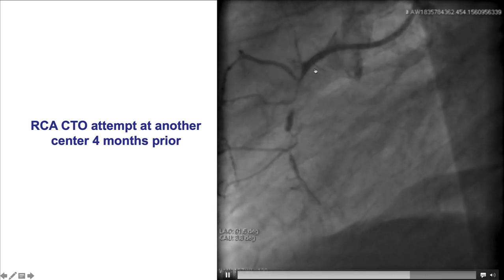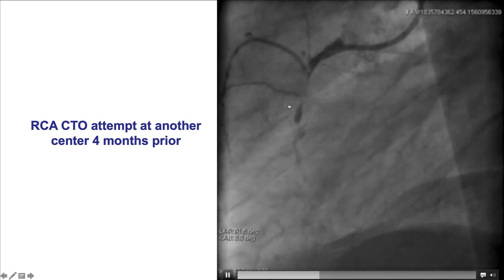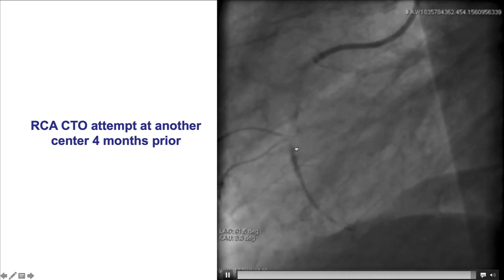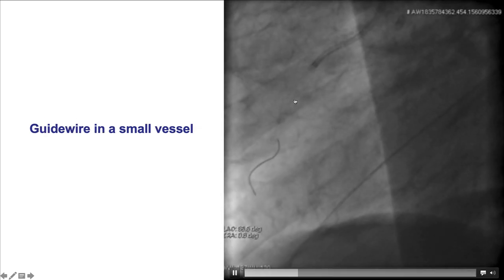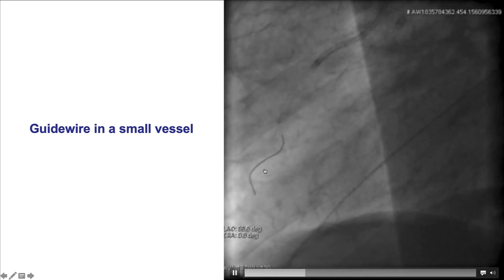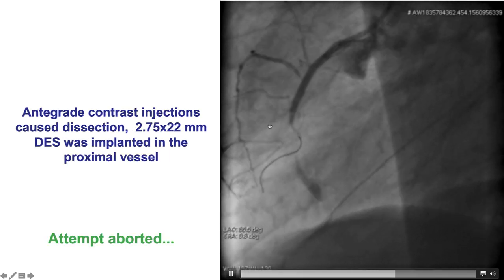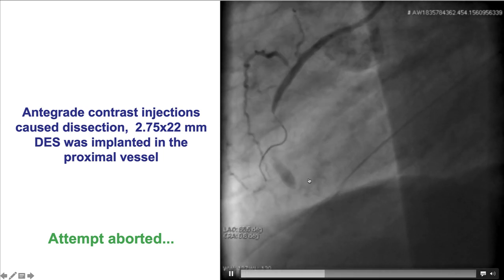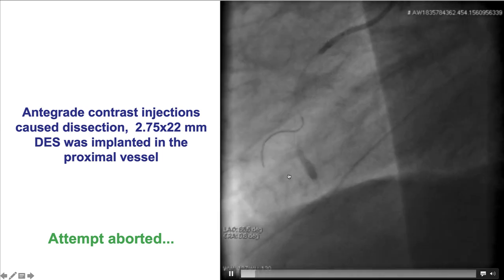These are the angiograms from the initial attempt to cross the CTO. There is a blunt proximal cap with a small branch at the proximal cap and diffusely diseased distal vessel. During antegrade wiring attempts, the wire went into the small branch and eventually there was a dissection in the proximal vessel, and a drug-eluting stent was placed extending with the dissection extending further down into the vessel.